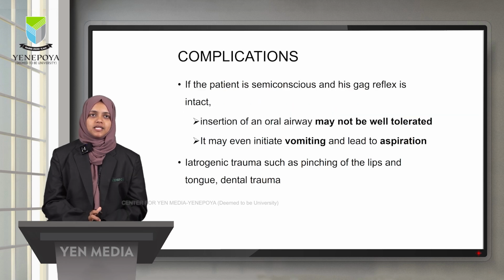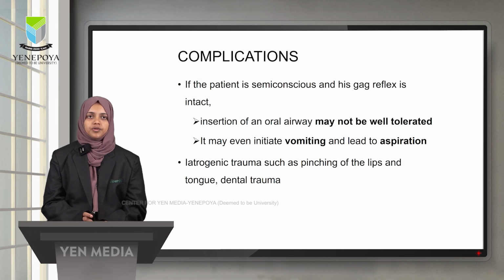Now coming to the complications. Always remember, before inserting an airway into a patient, confirm that he is unconscious, because if a patient is semi-conscious and his gag reflex is intact, insertion of an oral airway may not be well tolerated. It might even initiate vomiting and lead to aspiration. There are also chances of iatrogenic trauma such as pinching of lips and tongue, and dental injuries.